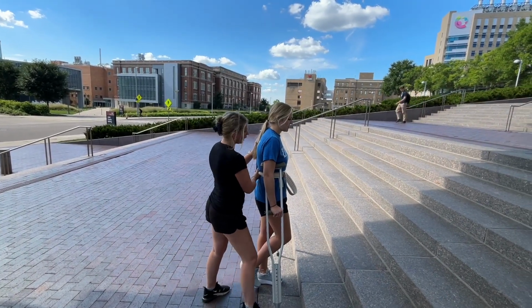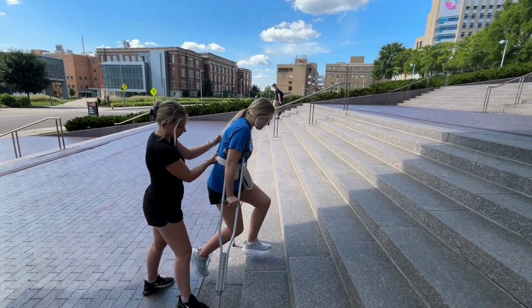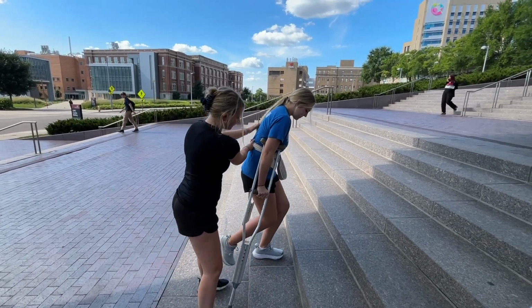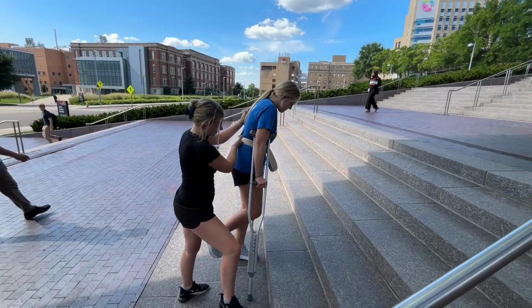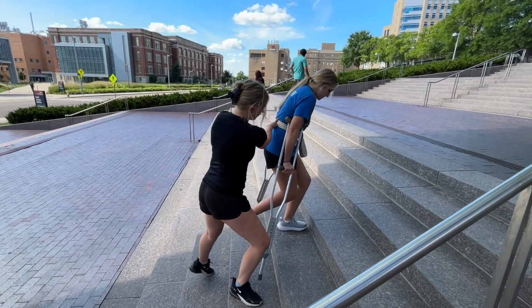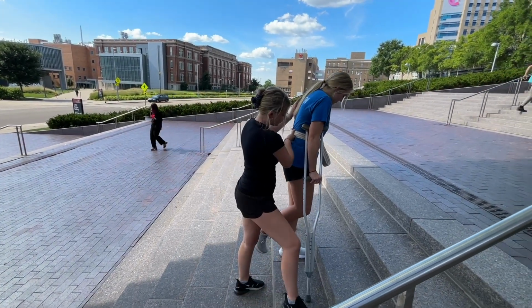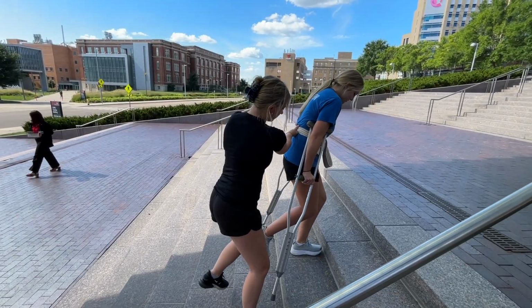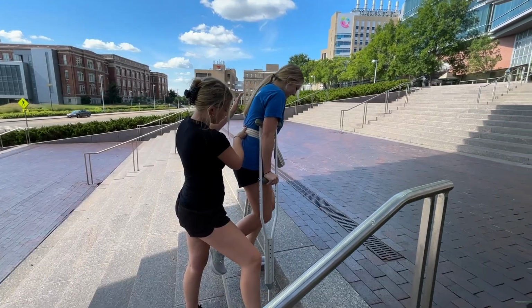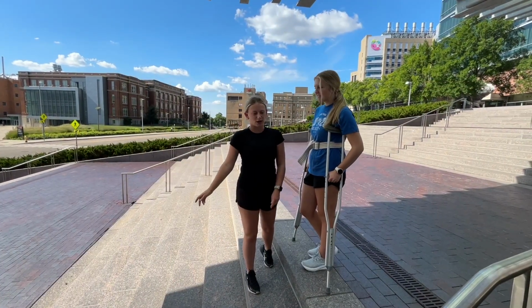To ascend a curb or stairs using bilateral crutches, the patient places the stronger lower extremity onto the curb or step and elevates the body while raising the crutches and the partial weight bearing lower extremity onto the curb or step. While the patient is moving, the PT should be walking behind them on the same side as the injured extremity with one hand on the patient's gait belt and the other hand over the opposite shoulder from the side you are at. Alright, now we're going to be going down the stairs with crutches.